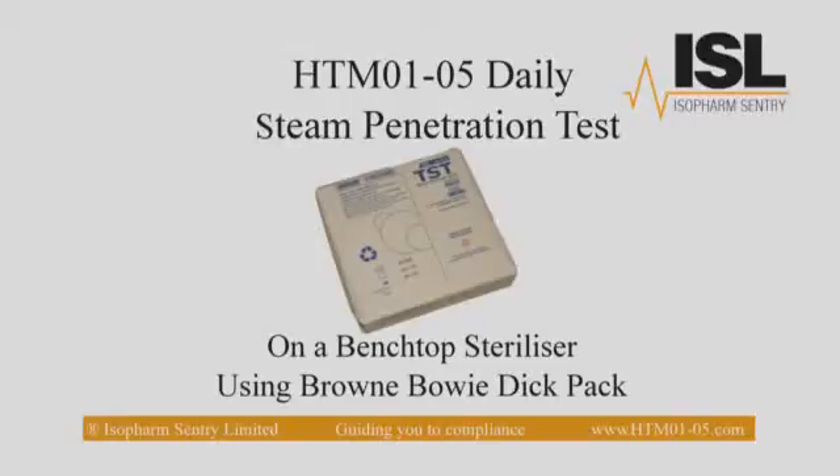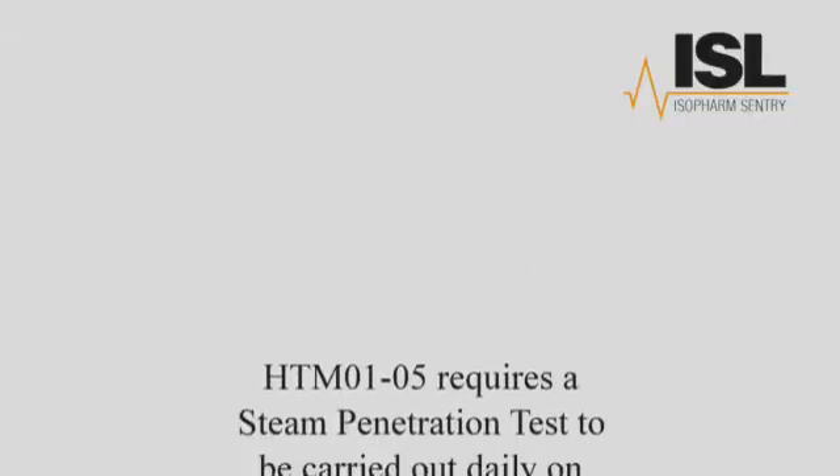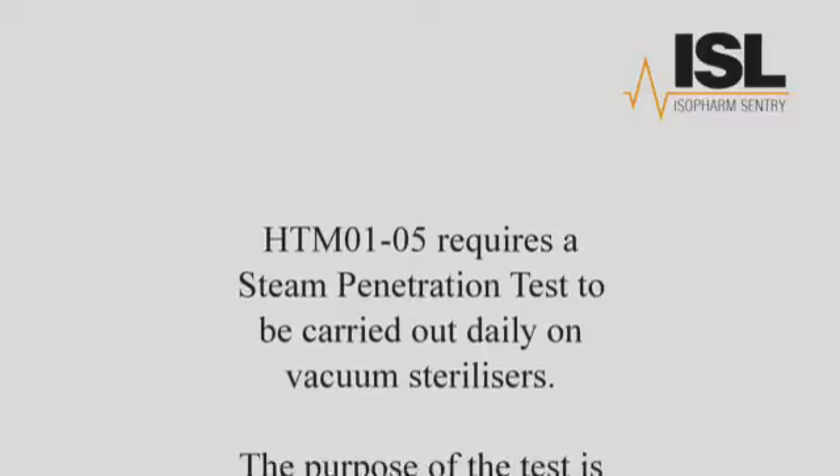HTM01-05 Daily Steam Penetration Test on a benchtop steriliser using Browne Bowie Dick Packs. HTM01-05 requires a steam penetration test to be carried out daily on vacuum sterilisers.